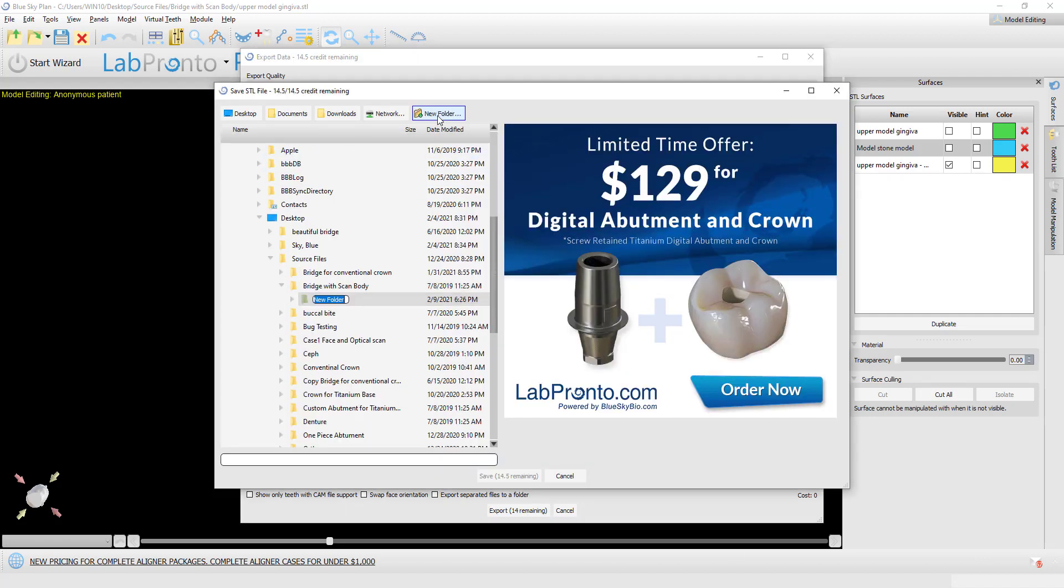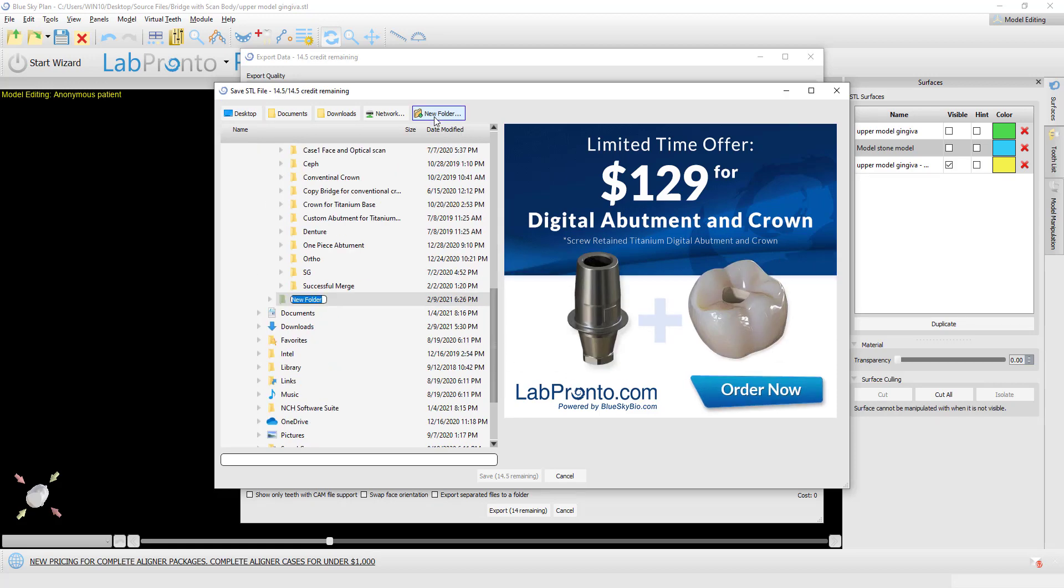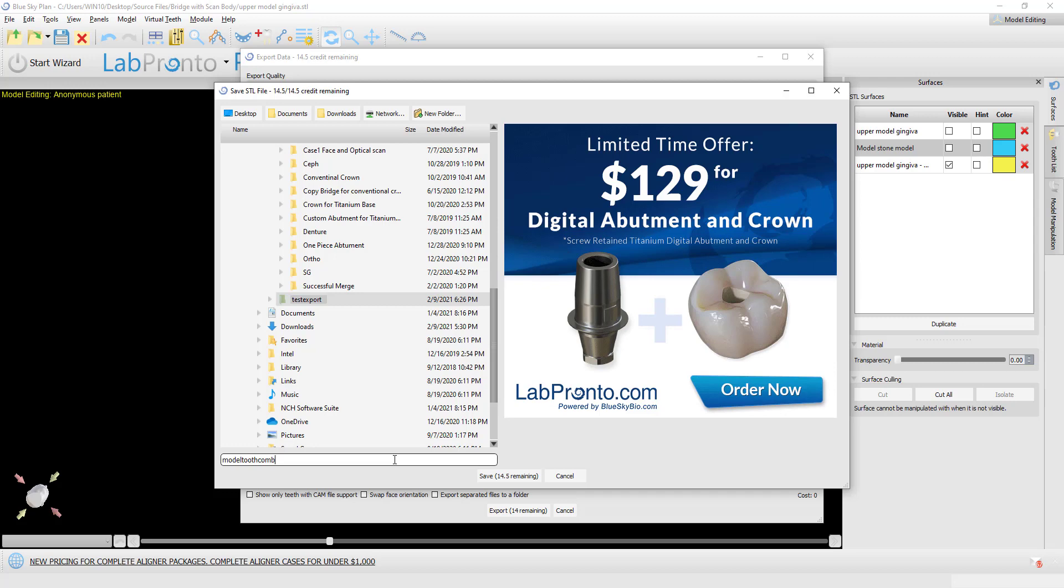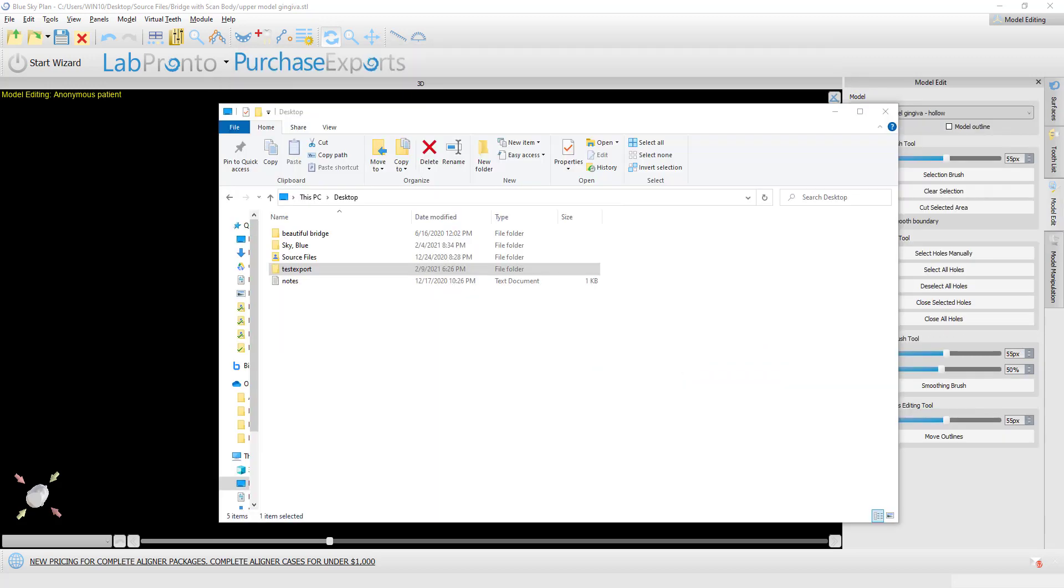Let's make a new folder on my desktop. Test export. Model tooth combined. And let's click on save.